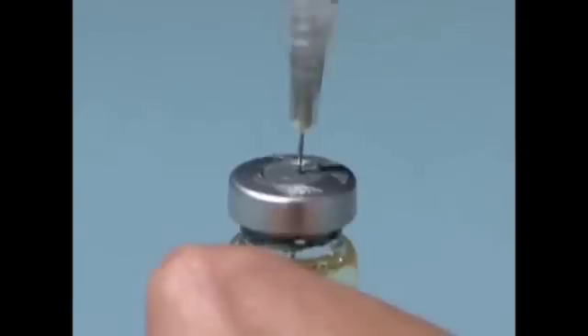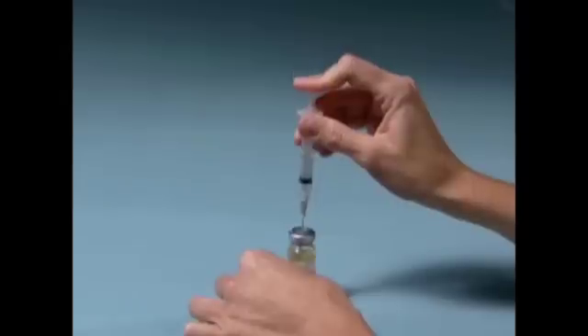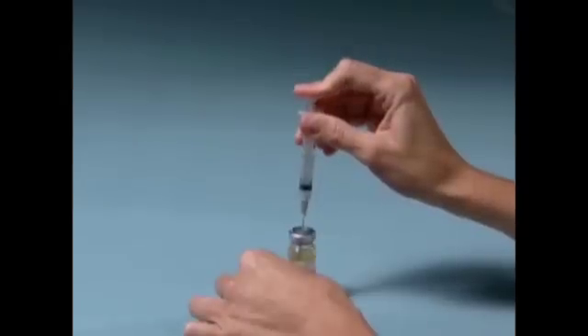Carefully insert the needle through the marked center circle of the rubber stopper. Gently press on the syringe plunger. This will allow the air to enter the vial, which makes withdrawing the solution easier.